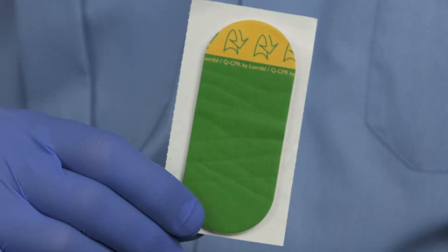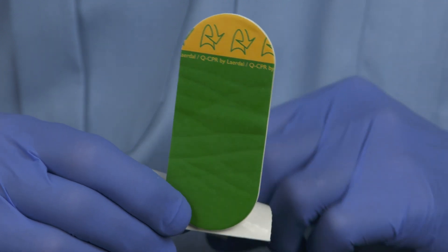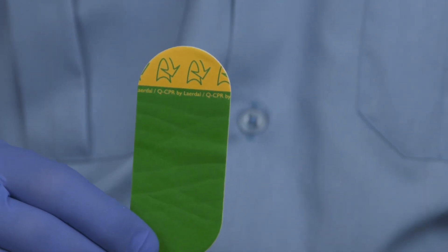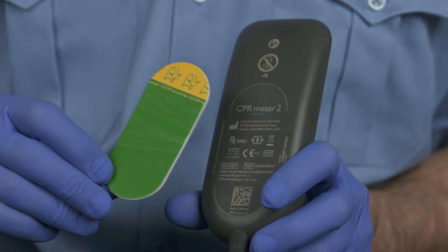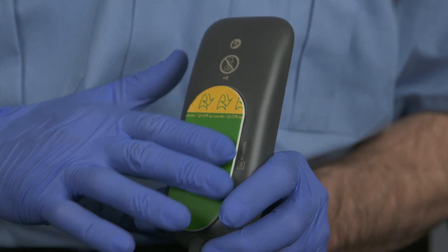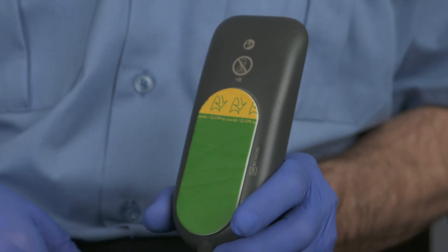To attach the adhesive pad to the meter, peel one pad off the strip, exposing the adhesive surface on the underside. Apply the pad to the back of the CPR meter, covering the entire flat oval surface. Do not peel off the green liner from the front of the pad until you are ready to apply the device to a patient.